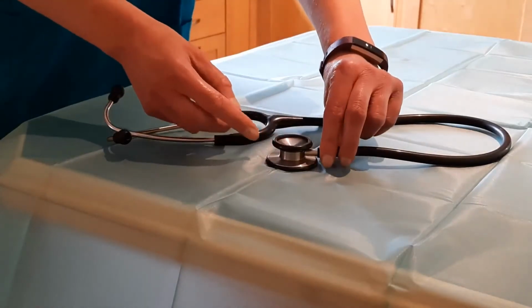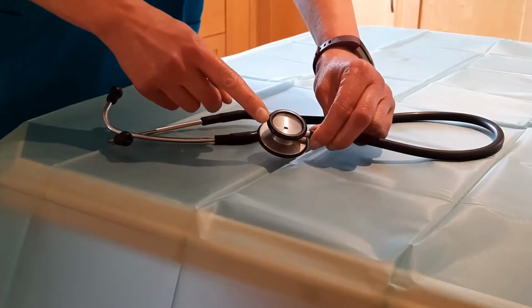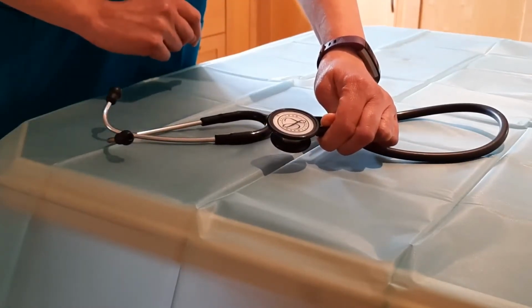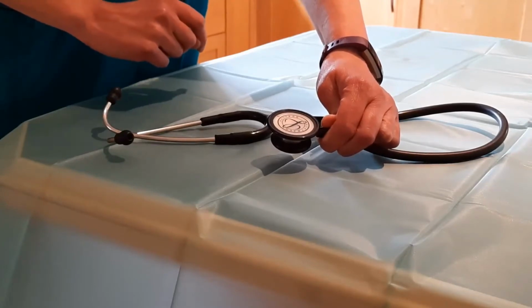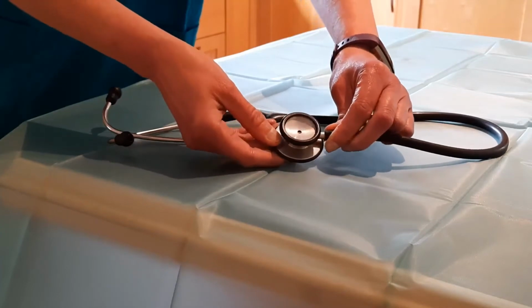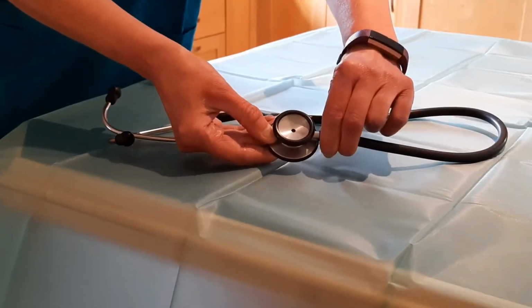This stethoscope has a double-sided chest piece. This domed side is called the bell and the flat side is called the diaphragm. We usually use the diaphragm in veterinary nursing. You can change between the two sides by twisting the chest piece.